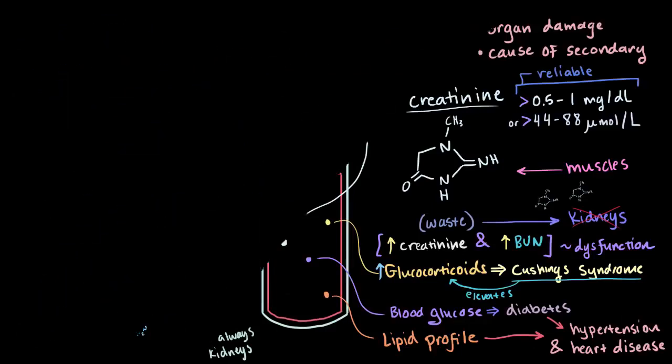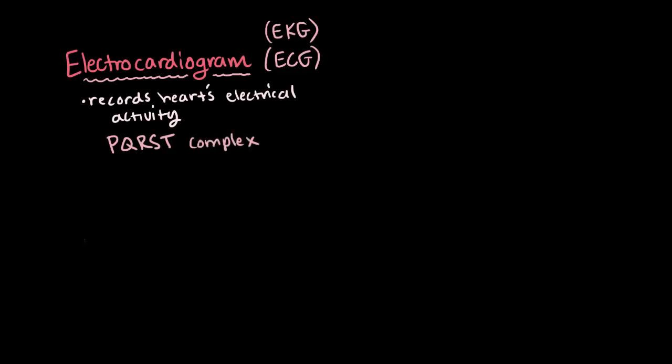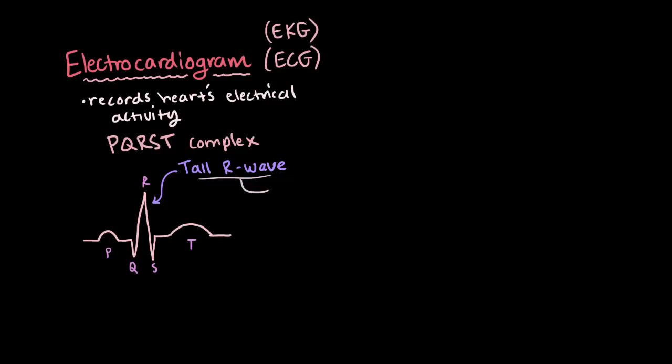Now, blood tests and pressure cuffs aren't the only diagnostic tools that we have. You might get something called an electrocardiogram, or ECG, or for the Germans out there, EKG. This test records and displays the electrical activity of your heart, and it'll often pop up as this characteristic PQRST complex, which looks a little something like this. And something that the physician might look for is this tall R wave, which is this guy right here. This is often seen with left ventricular hypertrophy, which can happen when your blood pressure is elevated for a long time.